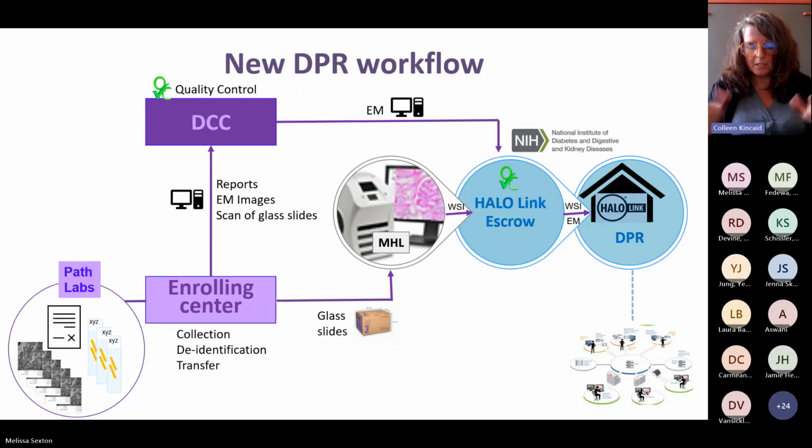So again, Melissa's going to explain it to you, but once you have those labels done on the slides, you're going to flip them over and put them on a copy machine and create a scan of the image. And that image gets uploaded, and that's part of our QC, is that Jess will pull it up and look at it, and then I'll give you feedback.